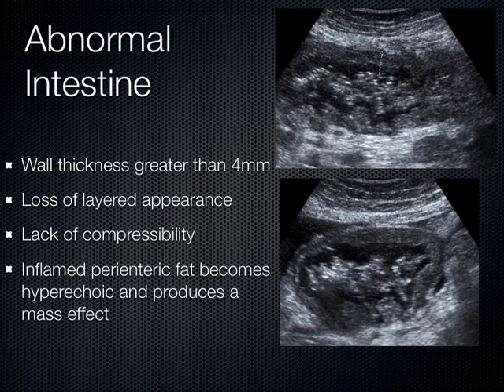Now, as you can see here, this is abnormal intestine. How do I know that? Well, I measured the wall thickness. We measure from the outside edge of the wall all the way down to where the lumen starts. And this is where the lumen is here. This is like stool and feces and a little bit of air. These little punctate things here, that's probably air. Whenever I see dots on the screen, those are almost always air. So the wall actually extends right to where the lumen starts. Over here, the wall would start here, all the way down to where the lumen starts. In fact, down here, the lumen starts right about here. So this is abnormal when we see it thickened like this.